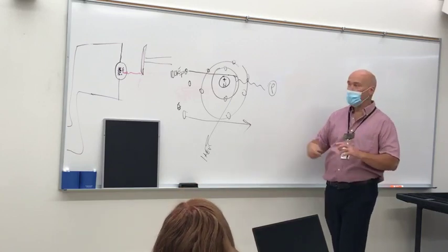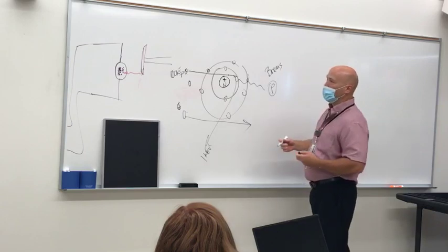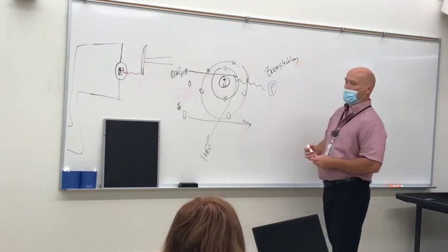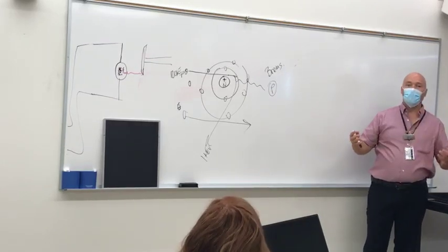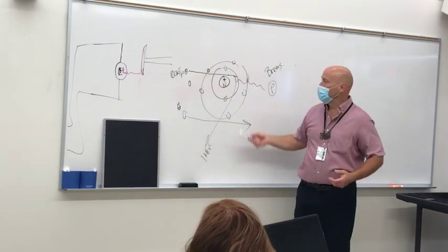We call it brems. Brems is not really an abbreviation, it's a shortened version of Bremsstrahlung. Bremsstrahlung is a German word for braking or slowing down. So this came in with a lot of energy.